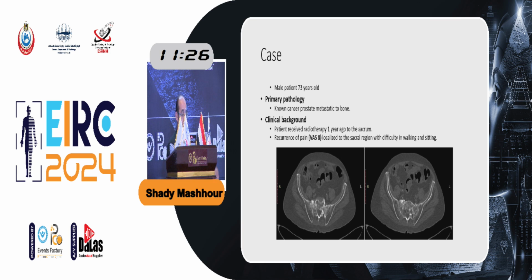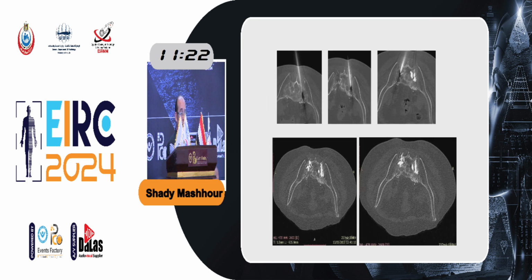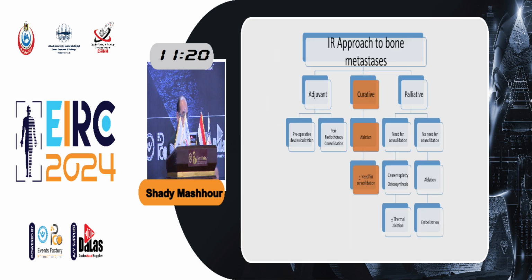This is a case of the following radiotherapy. He had prostate cancer, he had severe pain, pathological fractures. We went in bilateral sacral approach, we did a cementoplasty, and the patient did well.